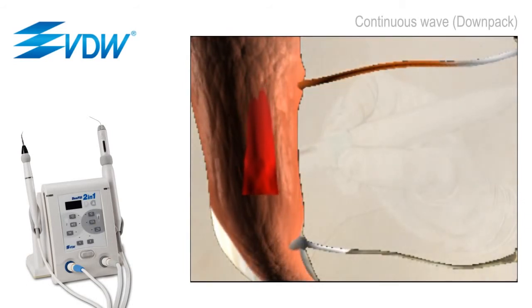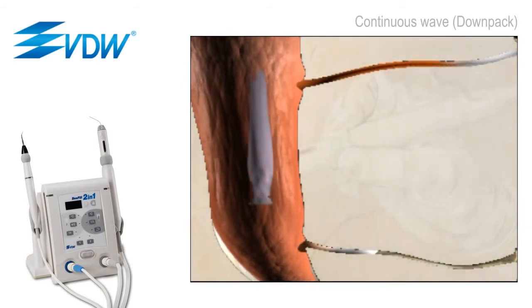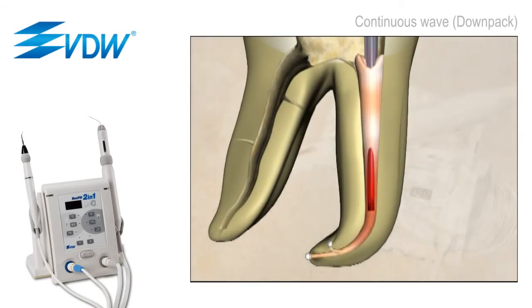Deep in the canal space, the heat is cycled off. Downward pressure is kept on the cooling carrier. This continued pressure in turn exerts pressure on the gutta-percha, forcing it into more lateral canals and anastomoses. After several seconds, and when the carrier has reached its ultimate depth, a second 1-second burst of heat is applied. 1 second later, as the carrier begins cooling, it is rocked side to side in the canal space.